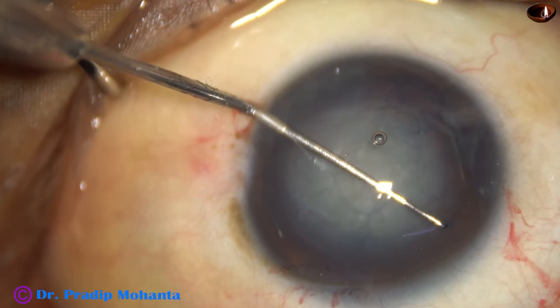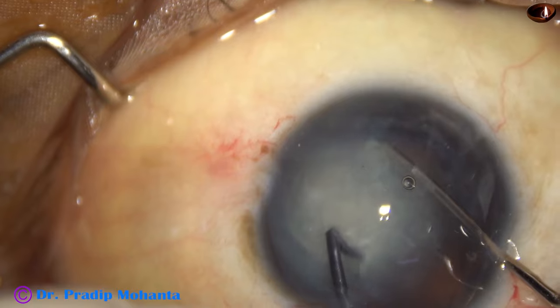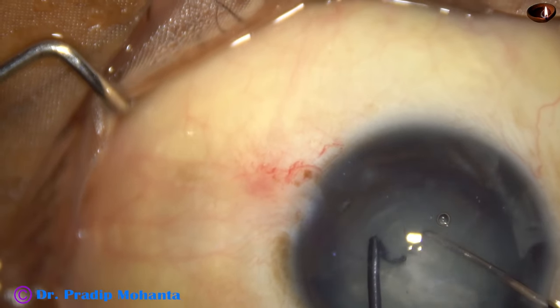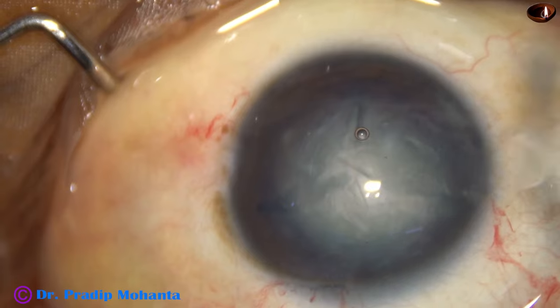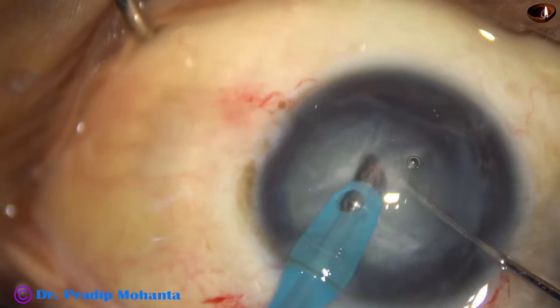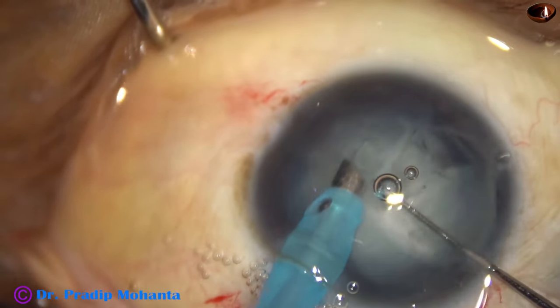Now I am using a pre-chopper to divide the nucleus. Because in weak zonules, it is better to use a pre-chopper if possible to divide the nucleus, then go into the anterior chamber with the handpiece. The handpiece is in my left hand and the chopper is in my right hand, and I am emulsifying the fragments.